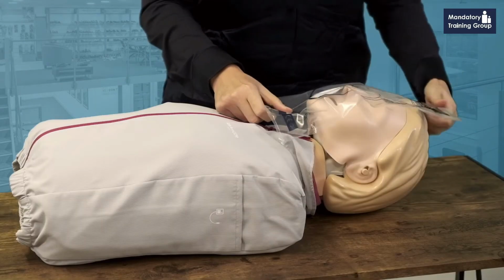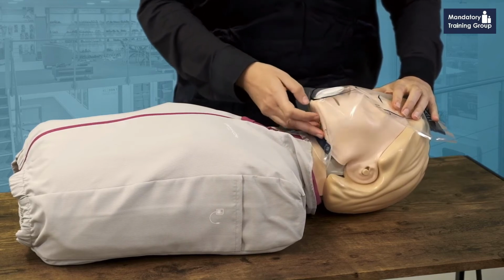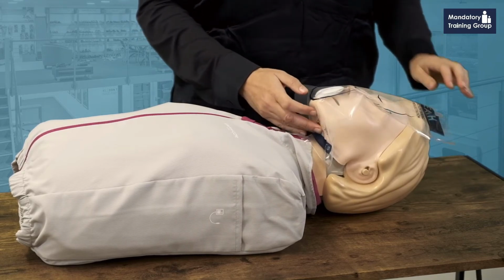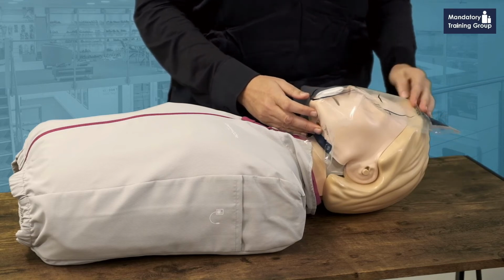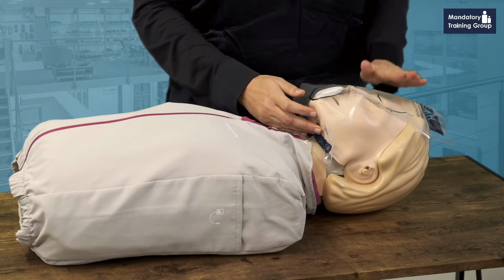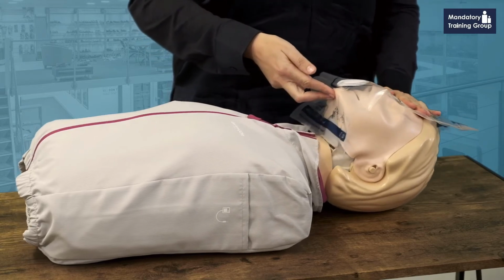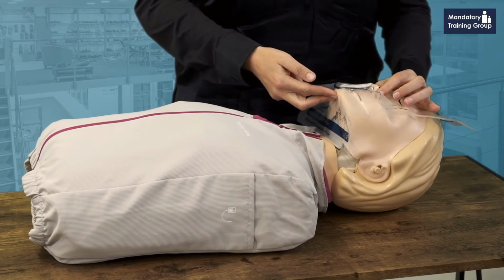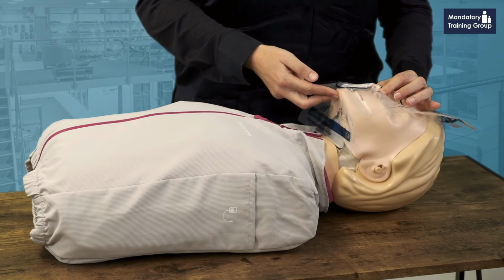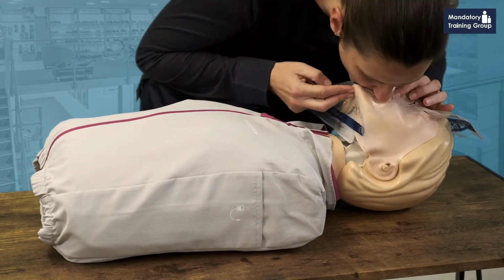So you put this on the casualty's mouth, and then you make a seal to make sure that no air is going through. And you do something we call the head tilt chin lift to open up the airway. So you have your hand on the forehead and two fingers on the chin, and then you're opening up the airway. And when you're giving rescue breaths, you pinch the casualty's nose and you give two rescue breaths. And you're blowing through that white part.